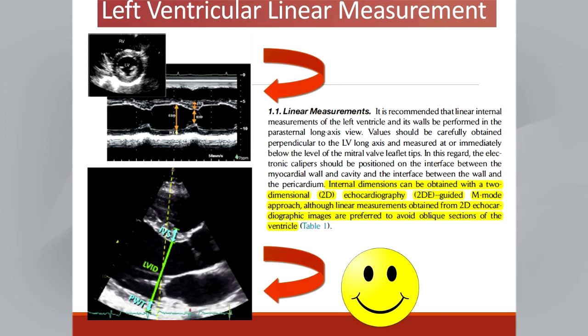Now, when we obtain the ventricular measurements, we are no longer recommending M mode and not even the targeted M mode to obtain these linear dimensions.